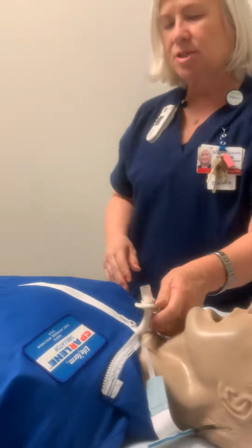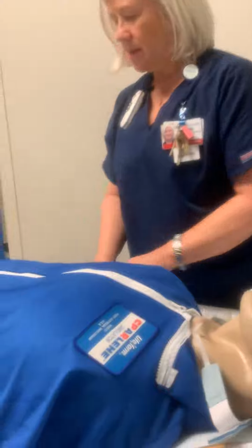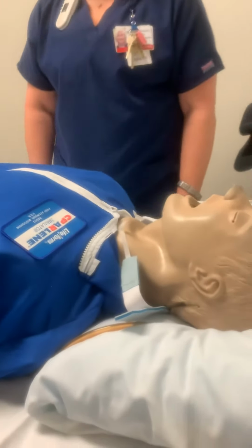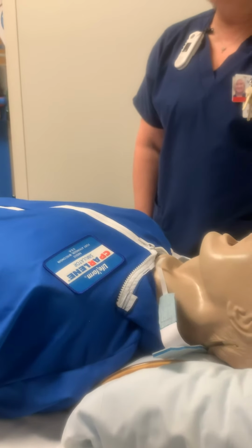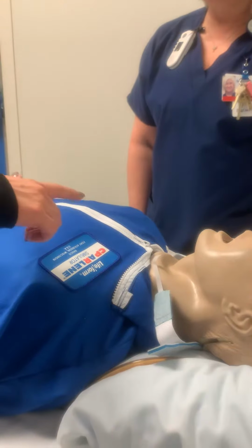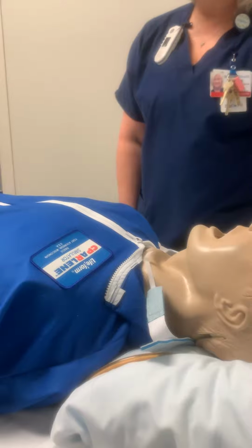And I have a trach tube in that falls out. What am I gonna do? Pop on up. Sorry, that's okay. I'm going to call SWAT. It's partial, you said? Partial laryngectomy. So call SWAT, and I could ventilate either place.